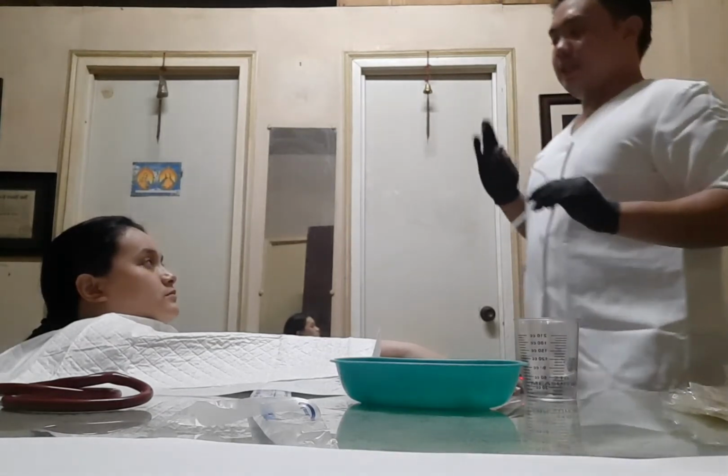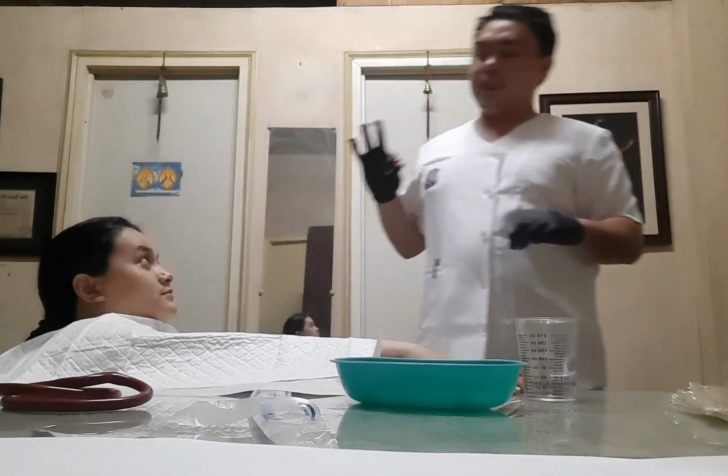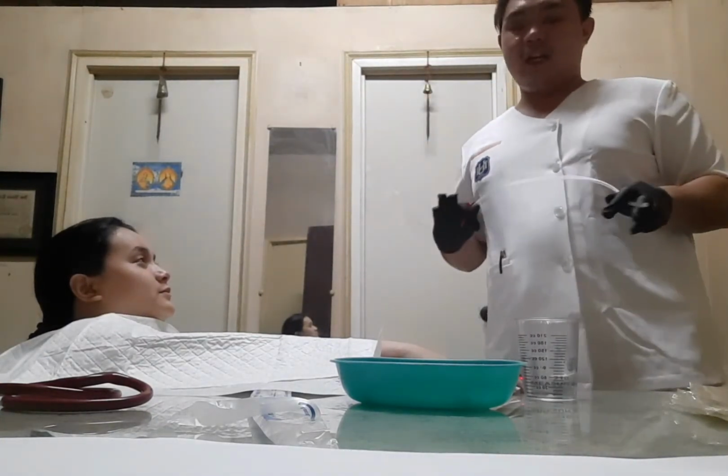And then ask the patient if he or she is already comfortable. Are you comfortable? Do you not feel injured in your nose or nostrils? No. Okay. So the patient's pulse rate is 90. It is in the average or normal range.